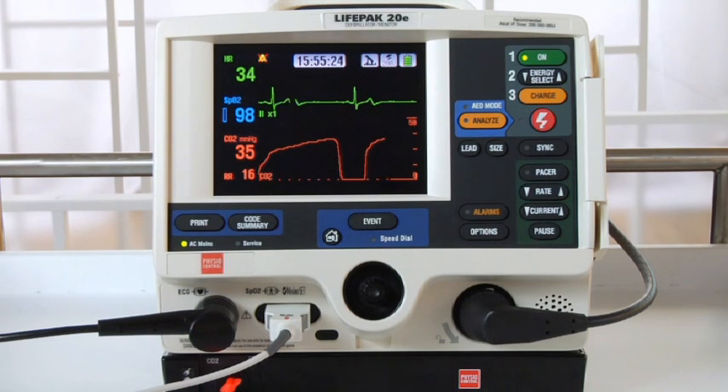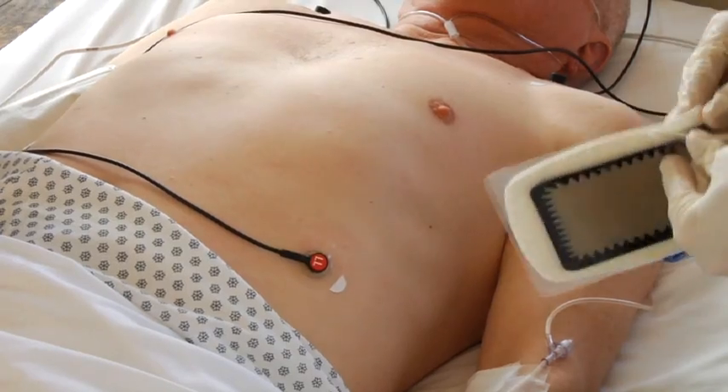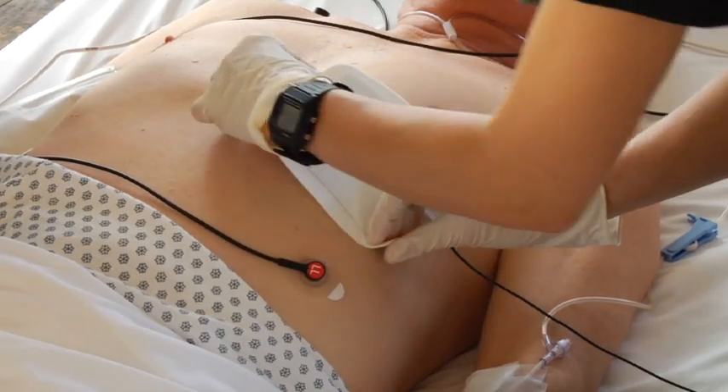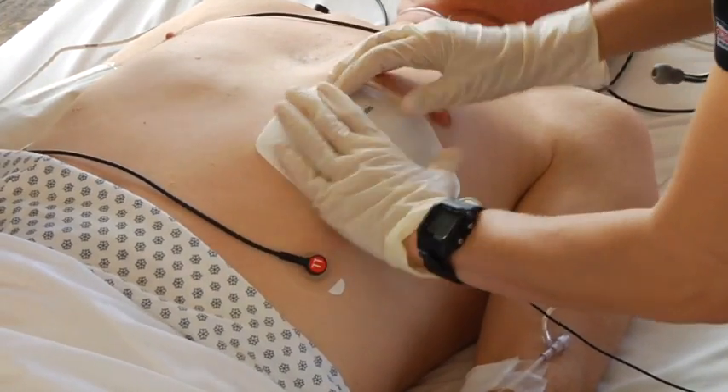We have the ECG leads on and lead two is displayed. Now we'll place the therapy electrodes. We'll use anterior-posterior here — you can use either the anterior-lateral or anterior-posterior position. Place the electrode with the heart icon over the left precordium, just below the nipple. It's important to put the electrode with the heart here rather than on the back.